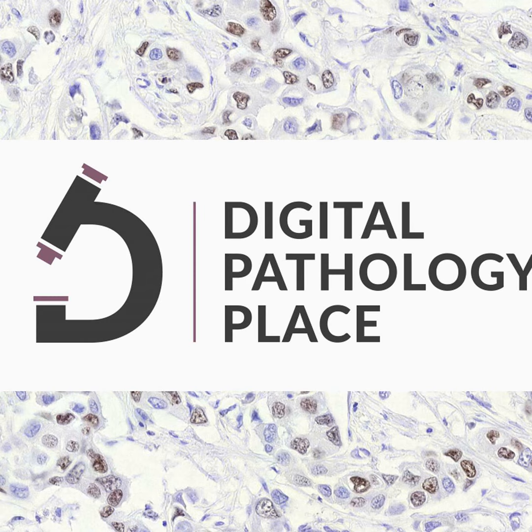Dr. Weinstein not only devised but also popularized the term telepathology to define the scope of this groundbreaking technology. His unveiling of this concept at the Armed Forces Institute of Pathology, AFIP, in 1986 marks a significant milestone in the history of telepathology.